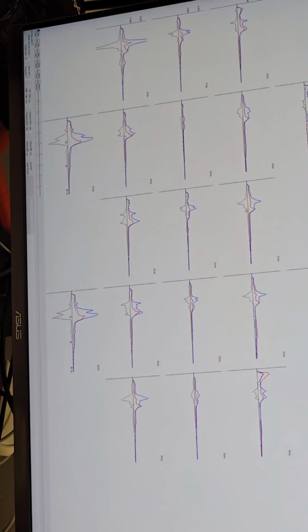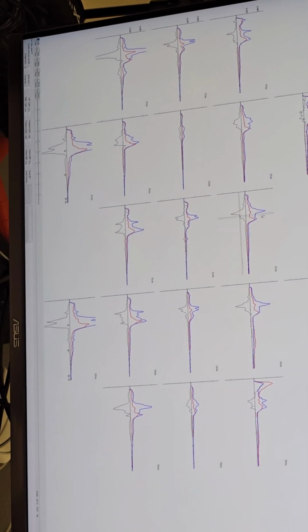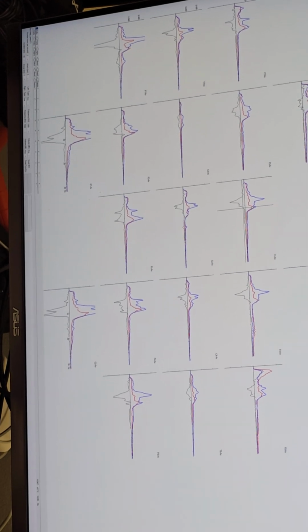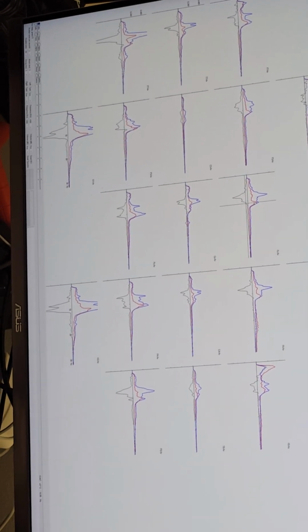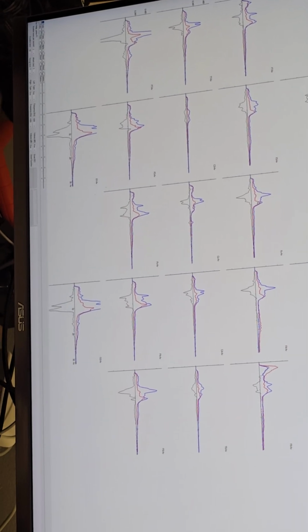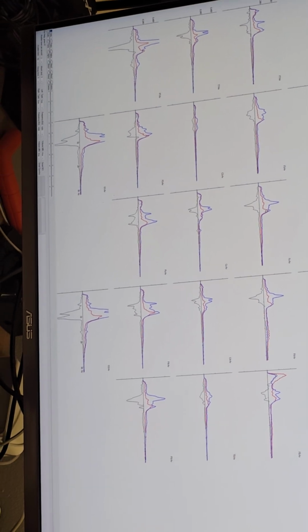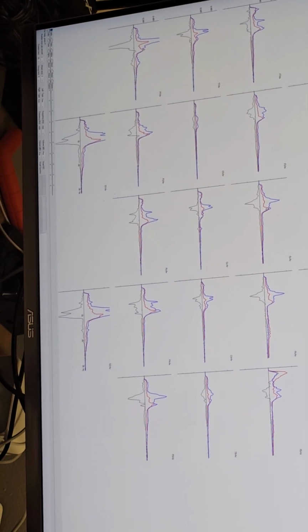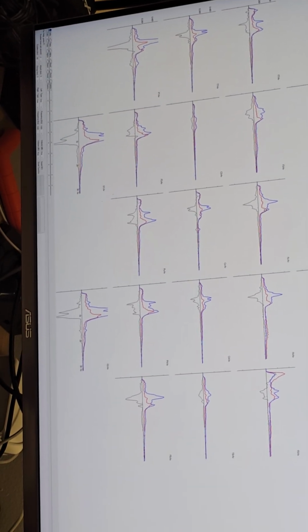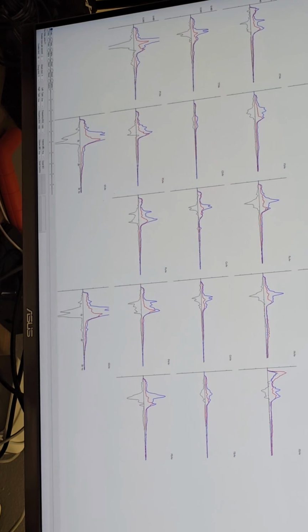What's pretty noticeable though is that 8.3 has sped up to this red here at 10 hertz. That's a big change. I would not attribute that to some caffeine. Now, it's possible that you're just much less drowsy. But considering all of the EEGs I've seen from you, the one from Peak Brain, the one from the MRI, and the first one, so that's 3, and they were all really drowsy. If you weren't drowsy last night, I might chalk that up to getting better sleep now.